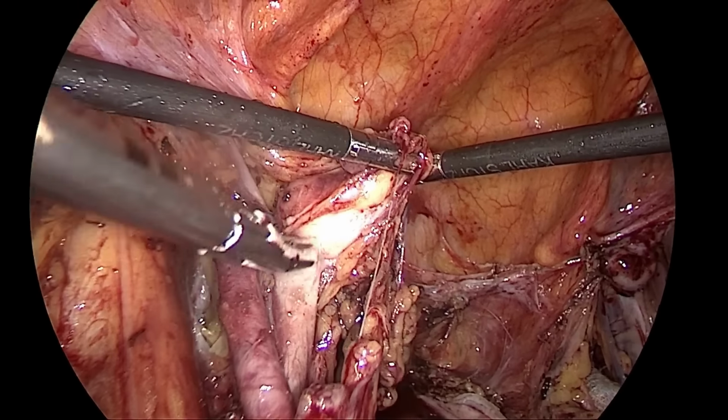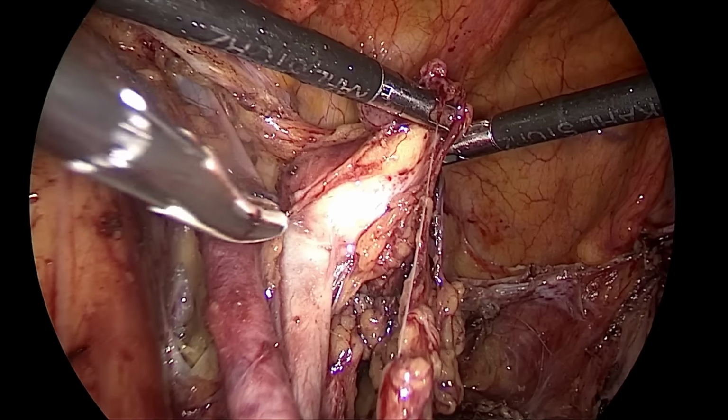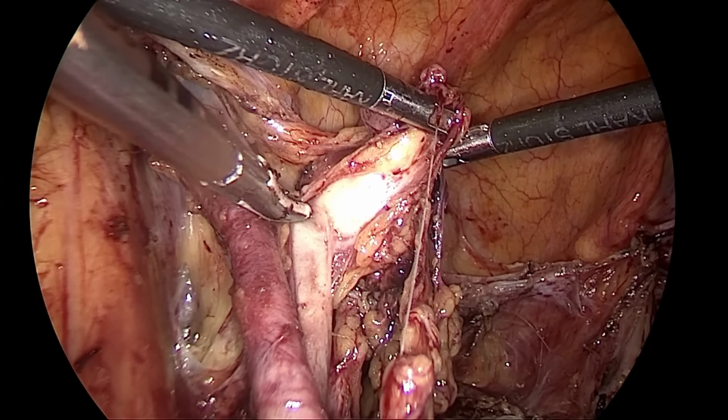Part of the vein is still attached with the node and I am trying to separate that. Now a plane is popping up.